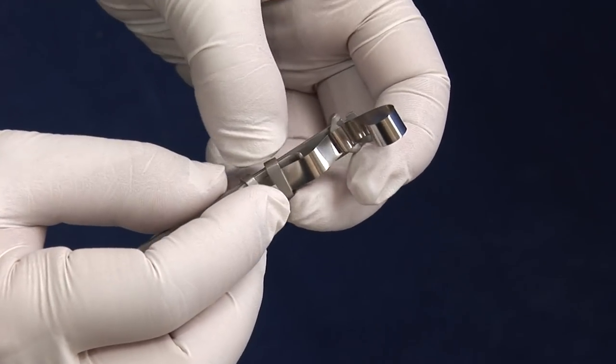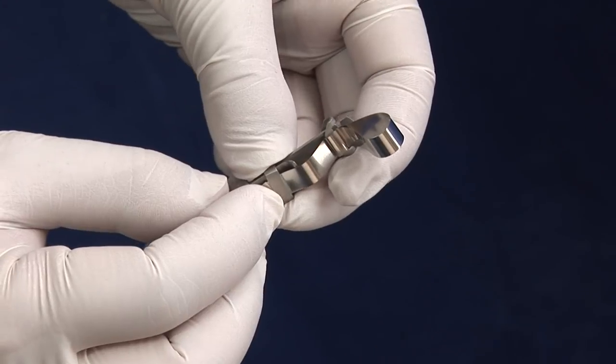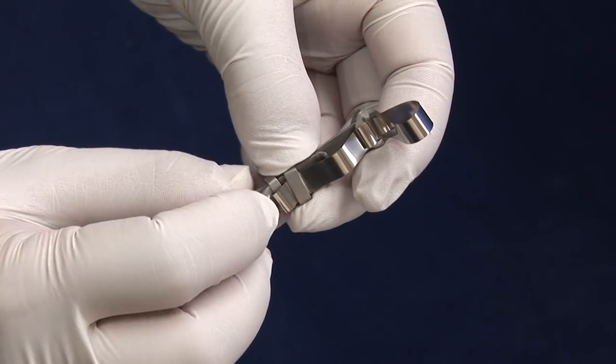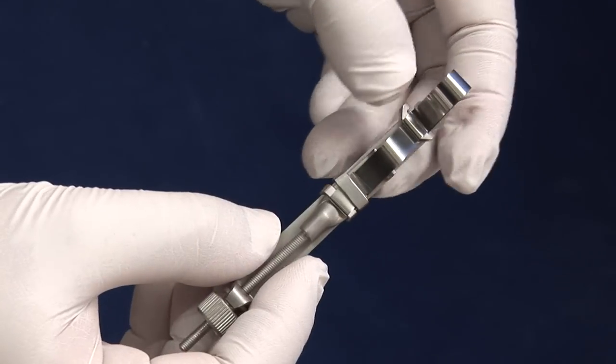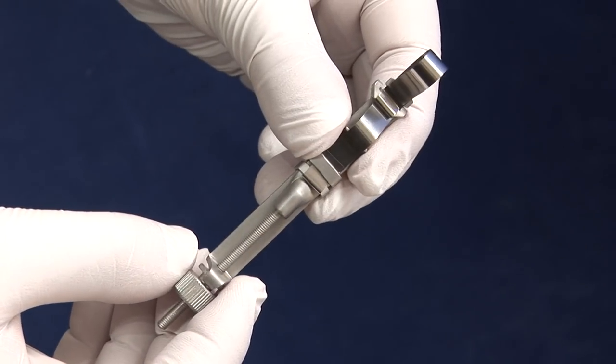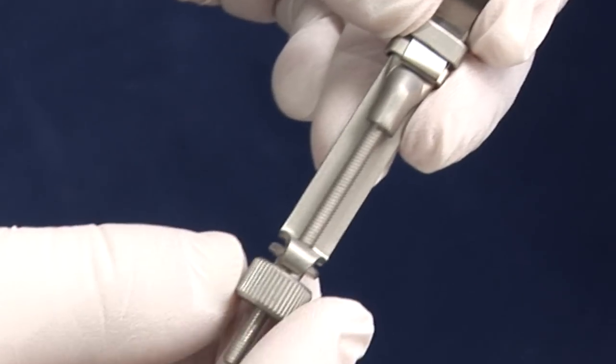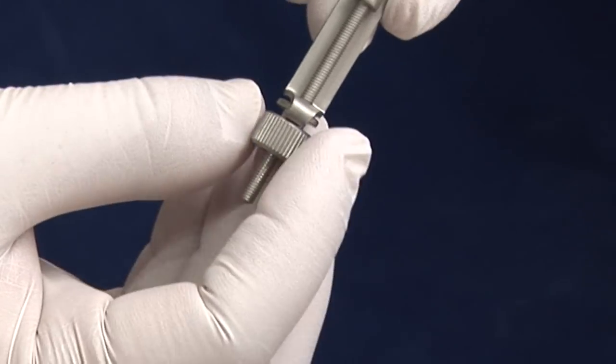Then bend the matrix band under and thread in between the locks. Press into place. This completes the preparation of the matrix band. Use the nut to adjust the size of the loop and make it smaller.